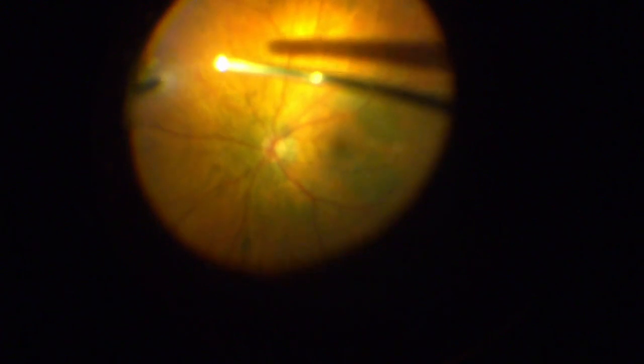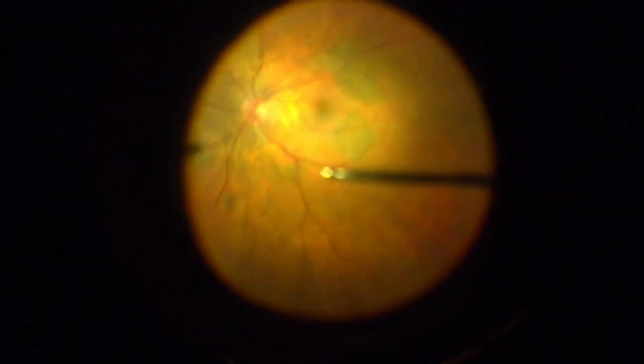She's asking about the gas bubble, the patient is. And we're probably going to give her air. It'll be gone in a few days, so it would be pretty short-acting. All right, now we're going to do our macular work, which is what we all came for.